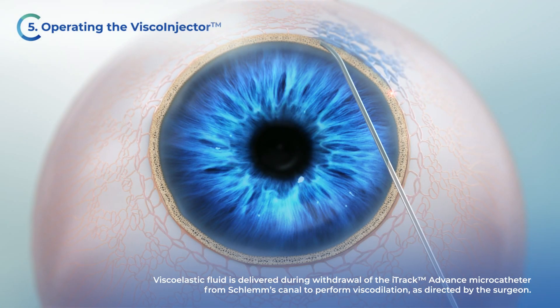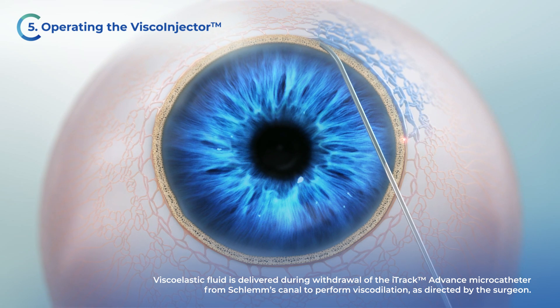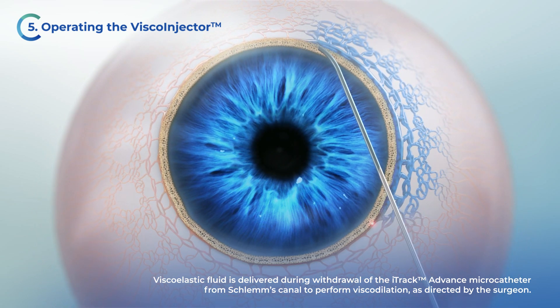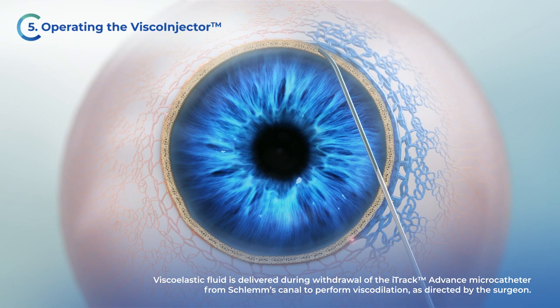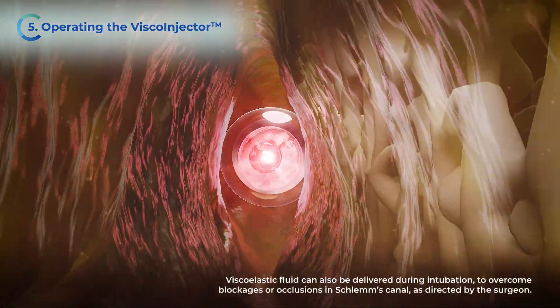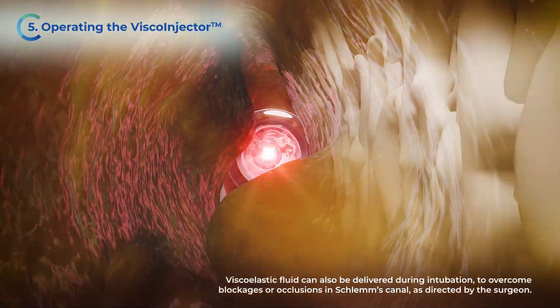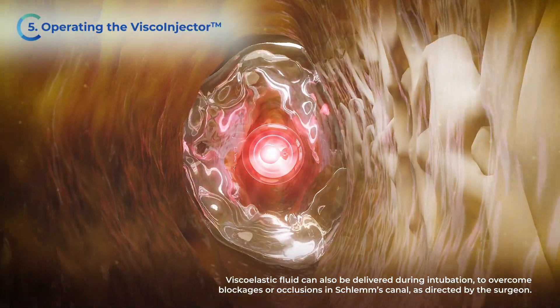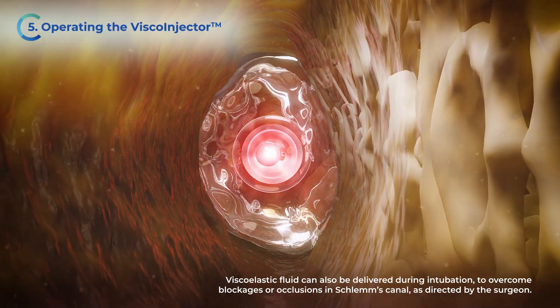Viscoelastic fluid is delivered during withdrawal of the iTruck Advance microcatheter from Schlem's canal to perform viscodilation, as directed by the surgeon. Viscoelastic fluid can also be delivered during intubation to overcome blockages or occlusions in Schlem's canal, as directed by the surgeon.